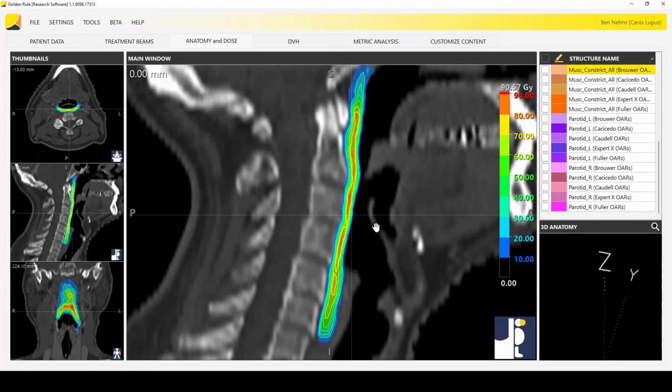what we see here is that it's just so spread out. This is basically a huge tail of disagreement. So people are starting at different places and stopping at different places. That would be the main source of variation. And again, I do think if people talk about it and set some rules and expectations, then we can start having more consistent contouring, which is going to lead to more consistent dosimetric DVH objectives that people are marching towards, and then hopefully the clinical trials and outcomes will be more reliable.